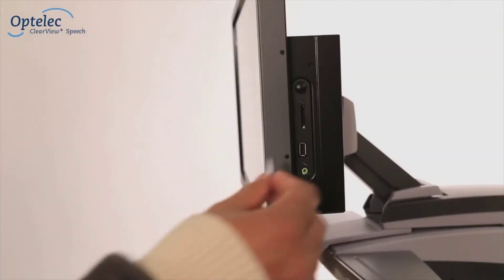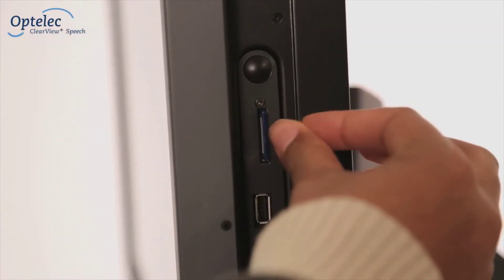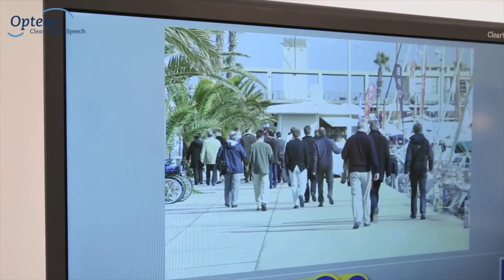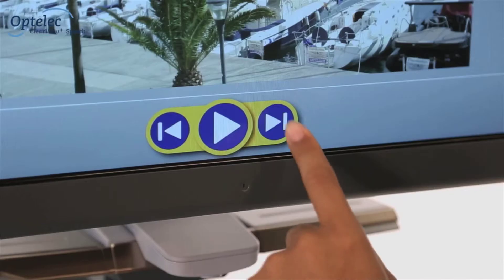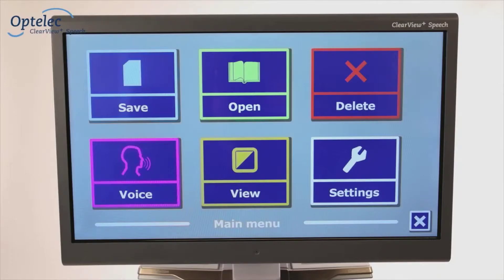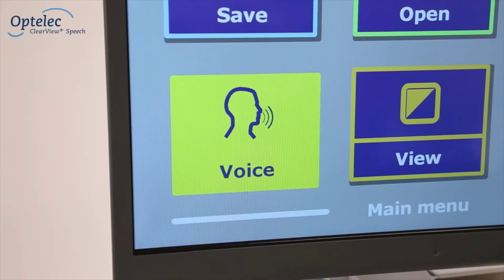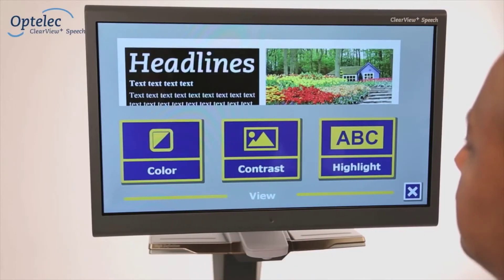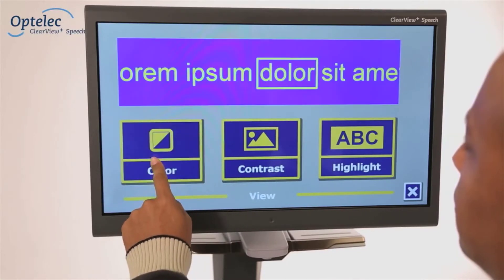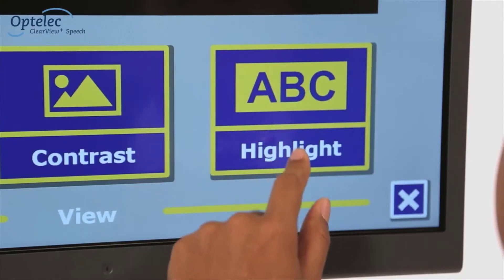You can save and open documents using an SD card or a USB drive. In addition to viewing documents, the Optala Clearview Plus Speech allows you to easily open photos. When using the Clearview Plus Speech, select the desired language and voice from the menu. The submenu for display options allows you to adjust the settings for contrast, the color of the text, and the read-along function.